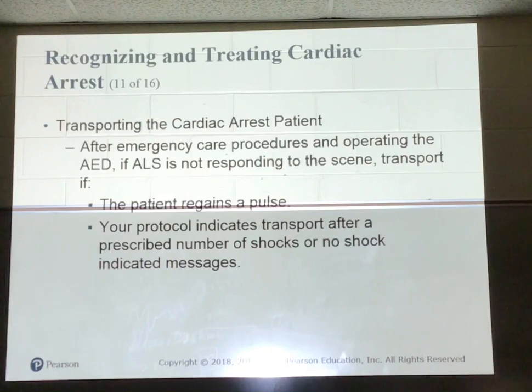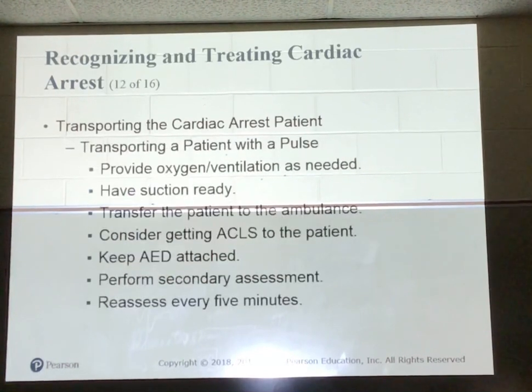Transporting. The patient you transport after defibrillation will be in one of two conditions, with a pulse or without a pulse. All right. After emergency care procedures and operating the AED, if ALS is not responding to the scene, transport if the patient regains a pulse or your protocol indicates transport after a prescribed number of shocks or no shock indicated messages.